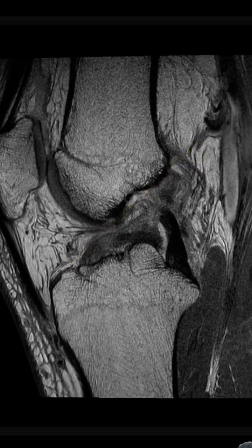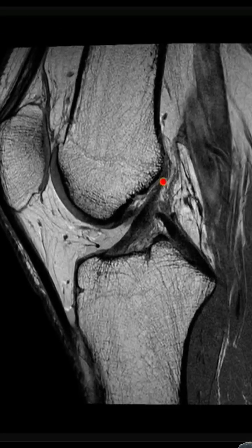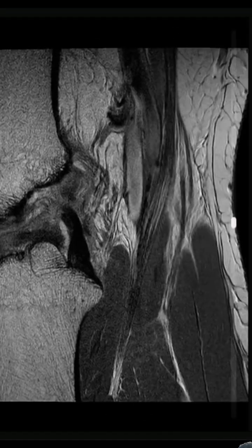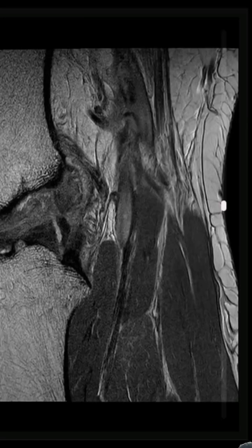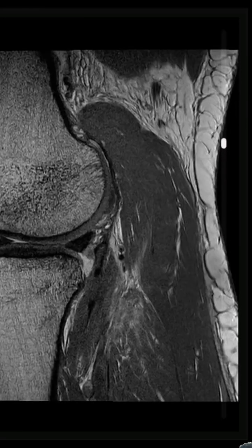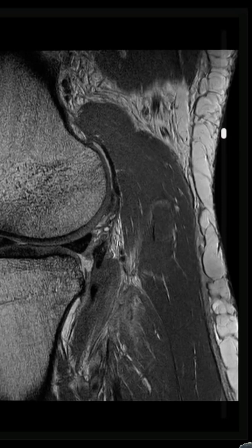For comparison, here is a normal anterior cruciate ligament which is seen paralleling the line of Blumensat. You will see also in our case that there are associated signs of ACL laxity.